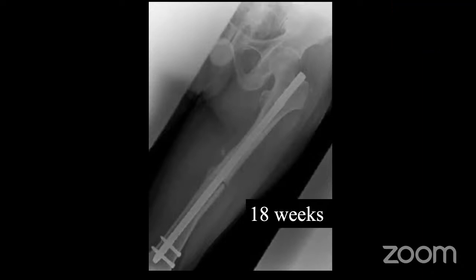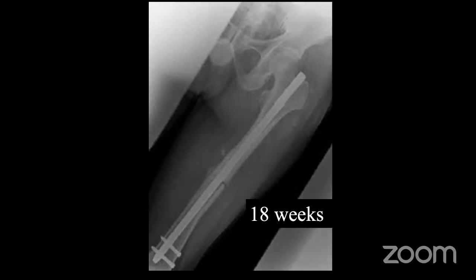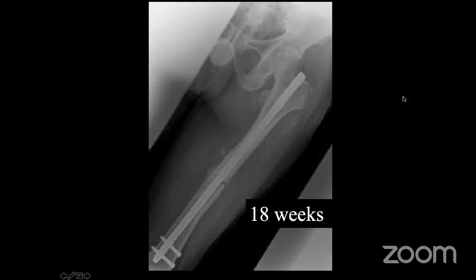The callus and the union of the fracture, the relation is not very good, and therefore this fracture will not heal. There is a ratio of the callus after dynamization and the fracture gap. The callus dynamization, there is some ratio. There is very little callus formation. Probably it may not heal.